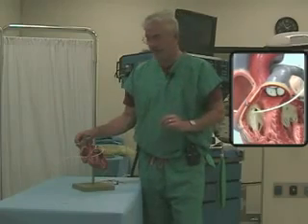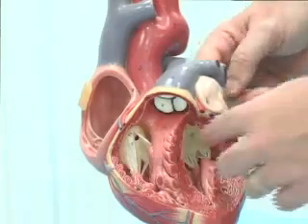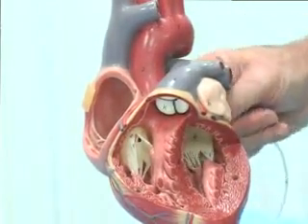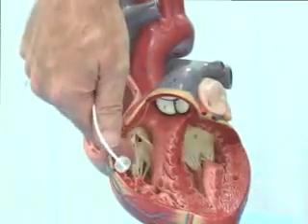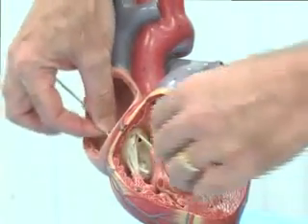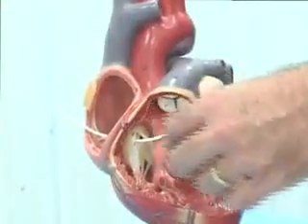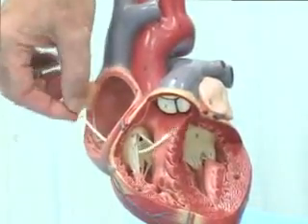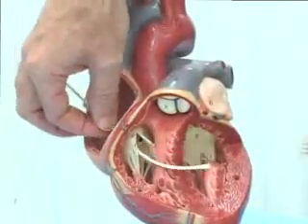Now for some pitfalls. One classic pitfall is putting the catheter in the wrong place — if it goes into the left ventricle, you'll get a very high pressure and know you're in trouble. If there's not much flow, the catheter can get hung up in the right ventricle — the heart is a very crowded place with chordae tendineae and papillary muscles. You can even get a knot in there. If the balloon ruptures, the catheter no longer has that air bubble to float it up and out, so it'll get hung up. Always double-check that the balloon is still working.